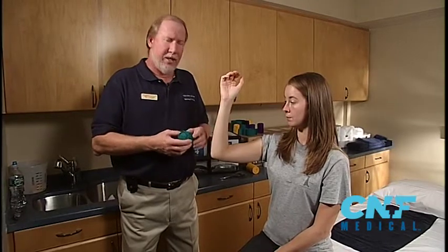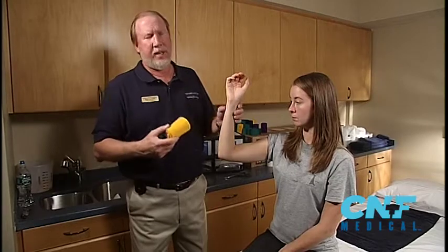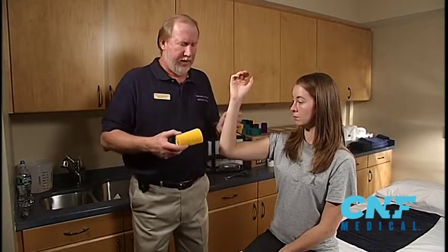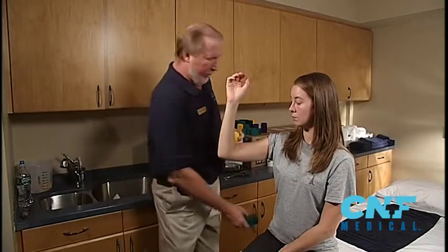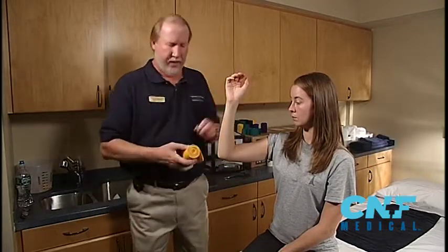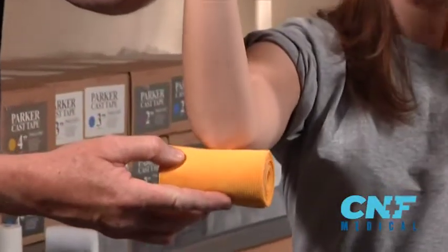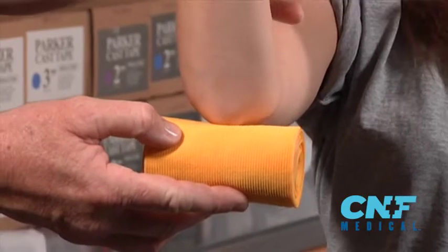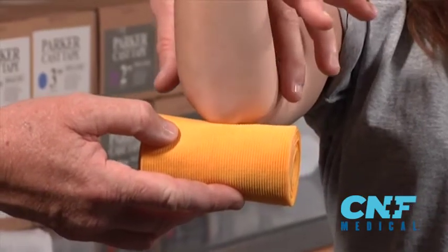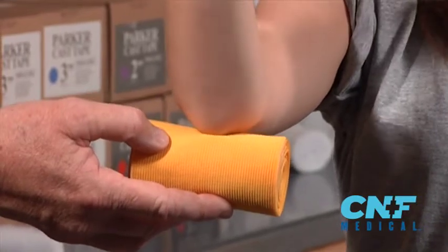Now what size do we need? The ACE bandage will be very helpful. Tape measures are good, but you spend more time looking for those. An ACE bandage you have it already. Take it and place it around the middle of the elbow. If you see a quarter to a half inch on both sides, four is fine. If not, then size up. If you see too much, like an inch on both sides, then size down. But four will be fine for this arm.